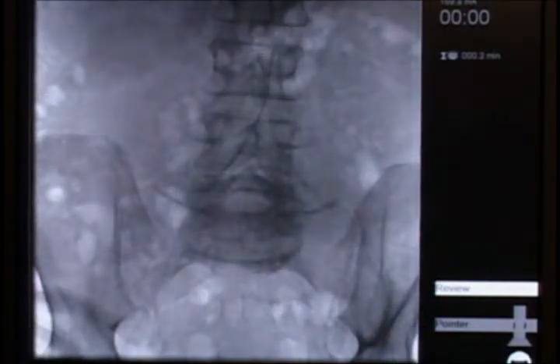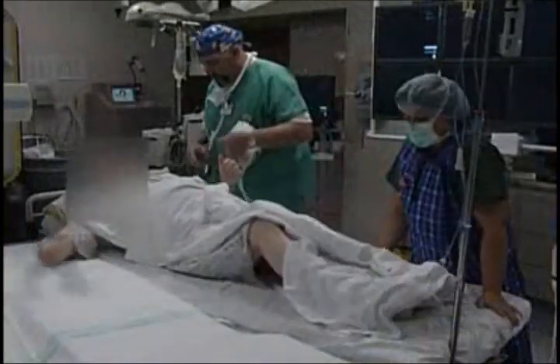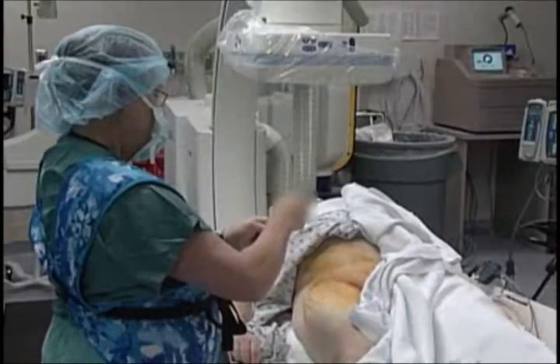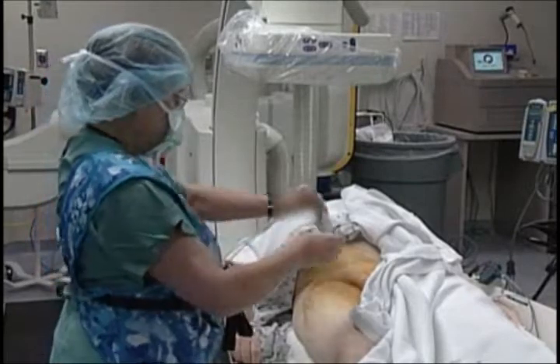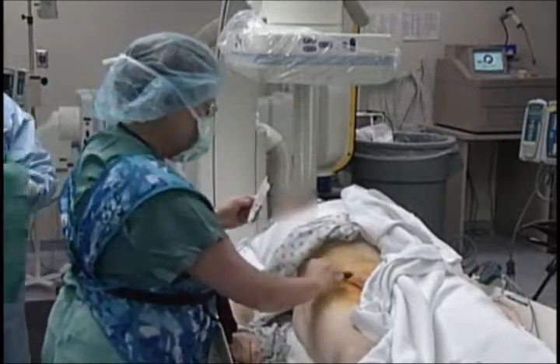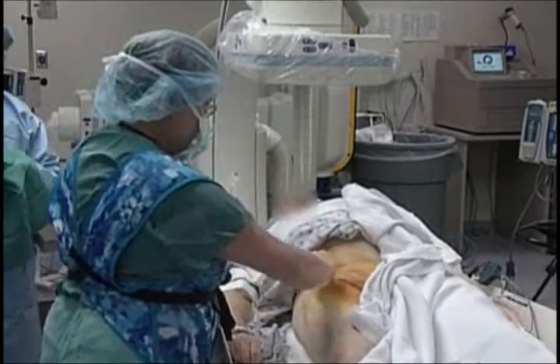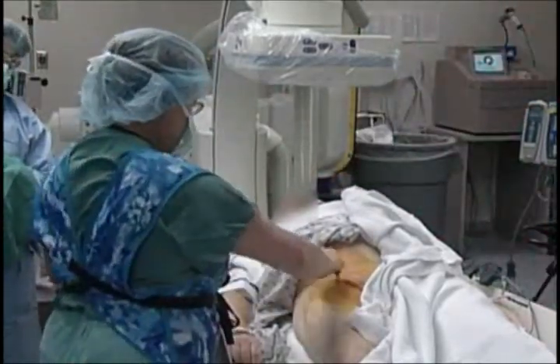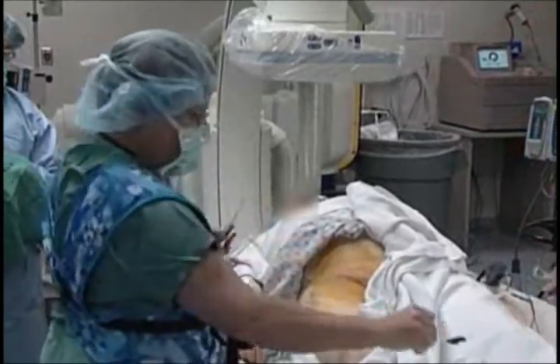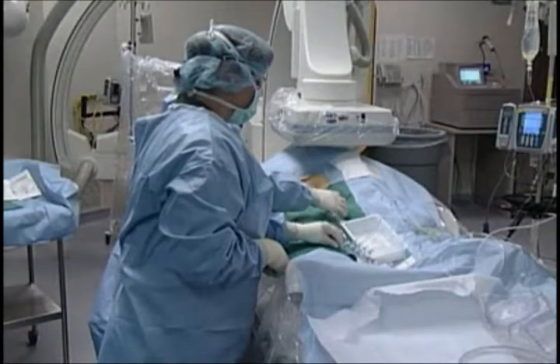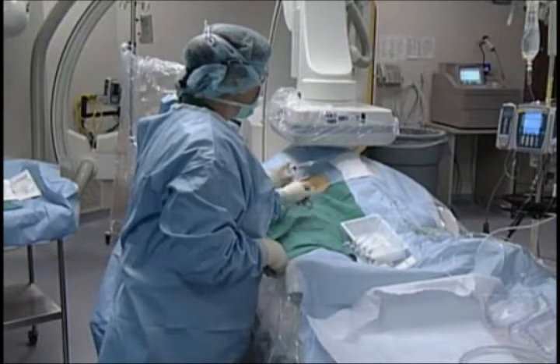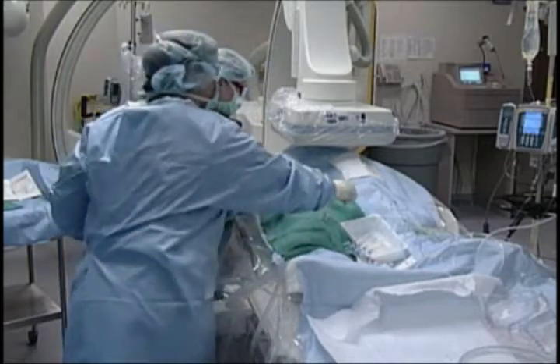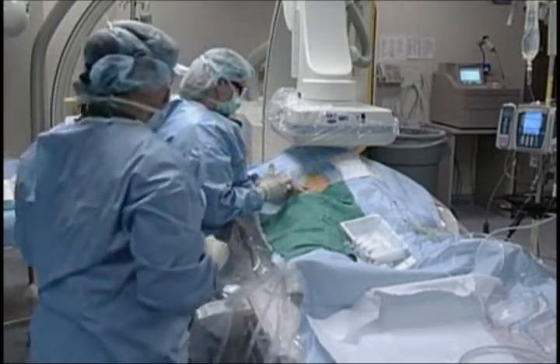This procedure is actually the 10th procedure for this patient. The patients come into our room awake. This procedure is performed with conscious sedation, usually at a level 1 initially and then deepened to a little bit deeper sedation later in the procedure. The level of sedation is similar to what one might have for a colonoscopy or an ERCP. Prepping the groin area there, we usually use a femoral artery approach, similar to what would be used for a heart catheterization. And as you're watching now, we're doing the local anesthetic.